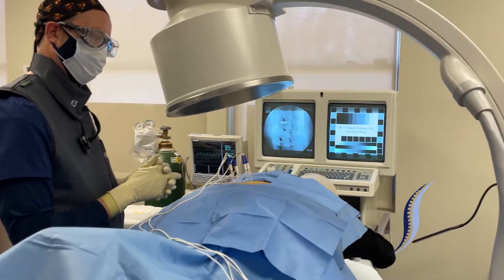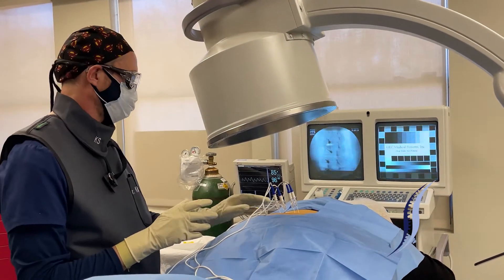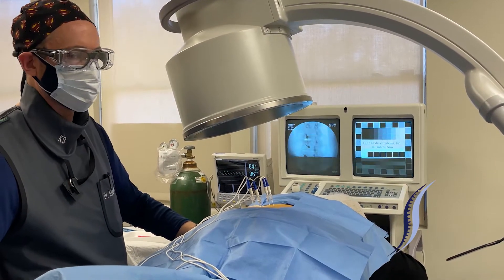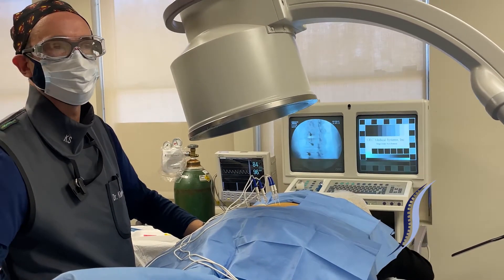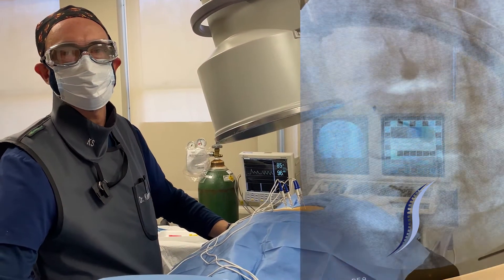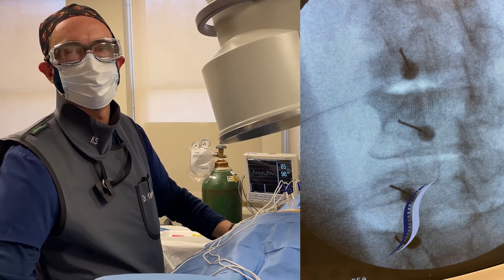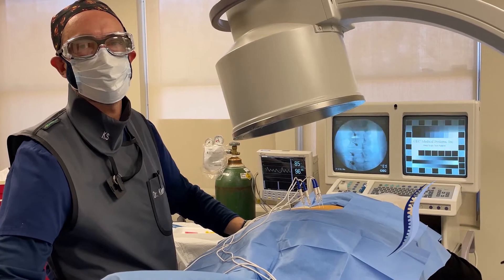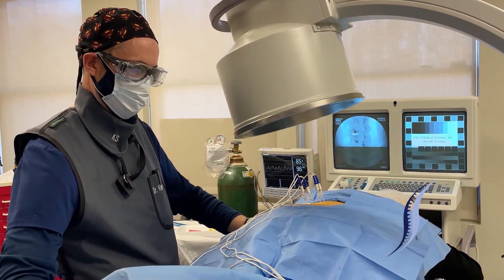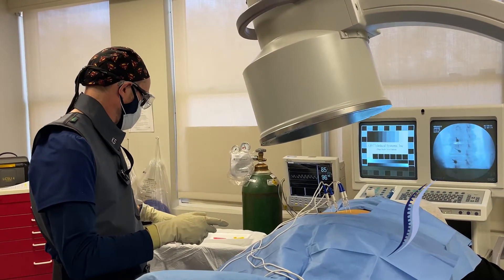Now we're going to do the motor testing. Motor testing allows us to make sure — you're going to feel some tapping sensation in the low back; it may go into the buttocks but should not go into the leg. What we want to make sure is that the needle tip is close to the sensory nerve but far enough away from the motor nerve, so that we get denervation of the sensory structures without any motor nerve denervation or ablation.